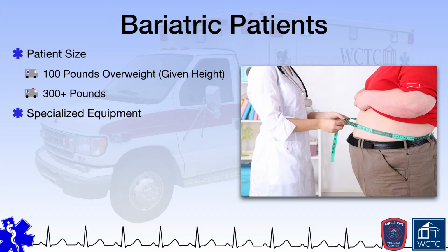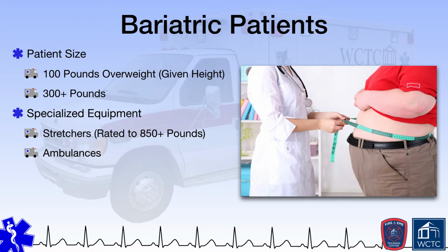For these reasons, many ambulance agencies are beginning to equip ambulances with specialized bariatric equipment, such as specialized bariatric stretchers with wider wheelbases and more load-bearing capacity that may accommodate up to 850 or 900 pounds, or power patient lifting devices to lift heavy patients off the floor so they can be more easily transitioned onto a stretcher. Some agencies have even begun modifying ambulances themselves to include ramps or winches to assist the crew with loading the bariatric patient into the back of the ambulance.